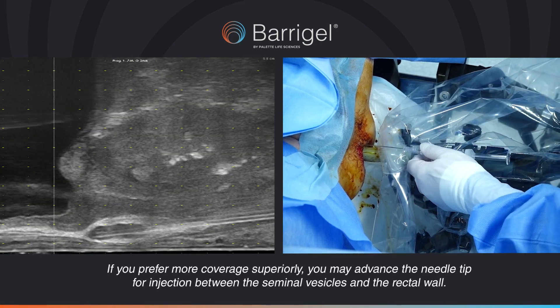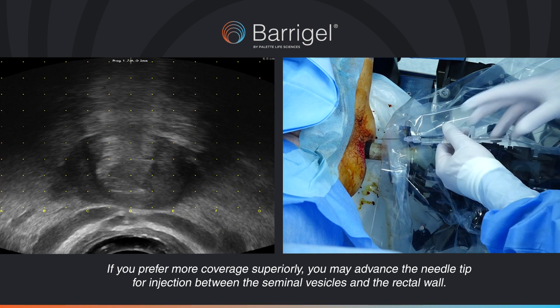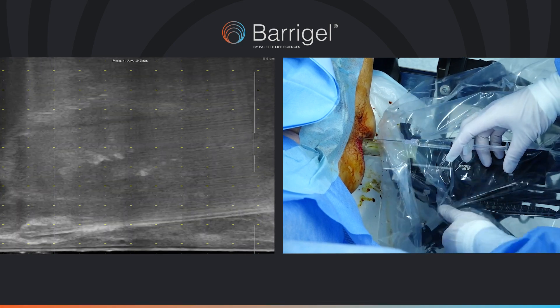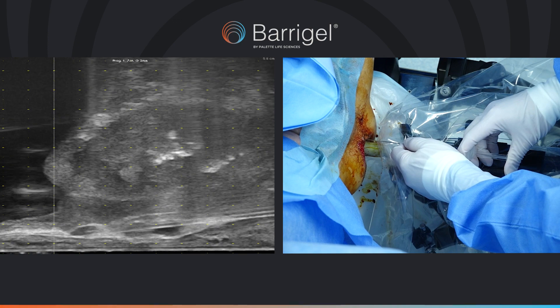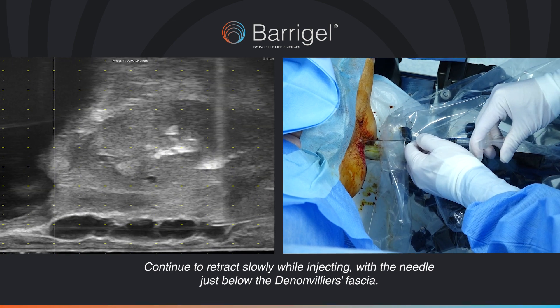If you prefer more coverage superiorly, you may advance the needle tip for injection between the seminal vesicles and the rectal wall. Continue to retract slowly while injecting, with the needle just below the Denonvilliers' fascia.